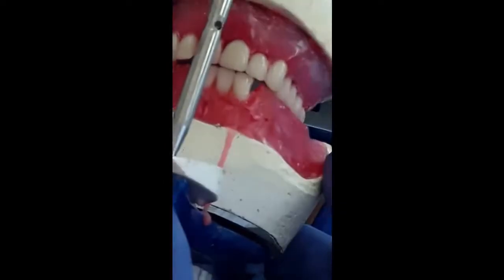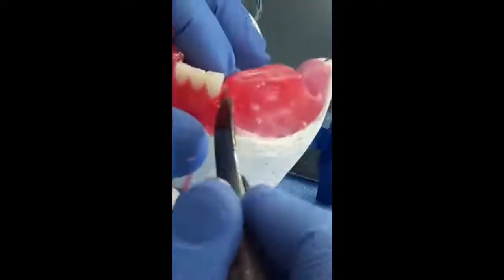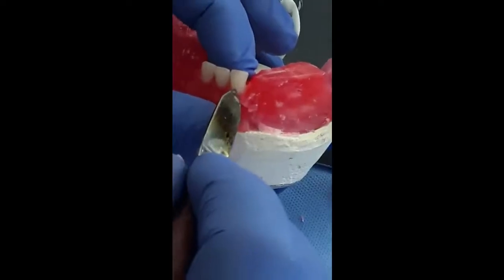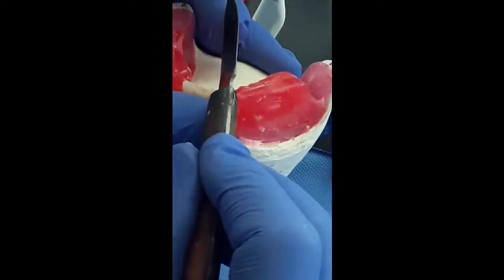Now we can see that we don't have enough overjet here. We have touched, so we move the tooth lingually to increase the amount of overjet, or the horizontal overlap.